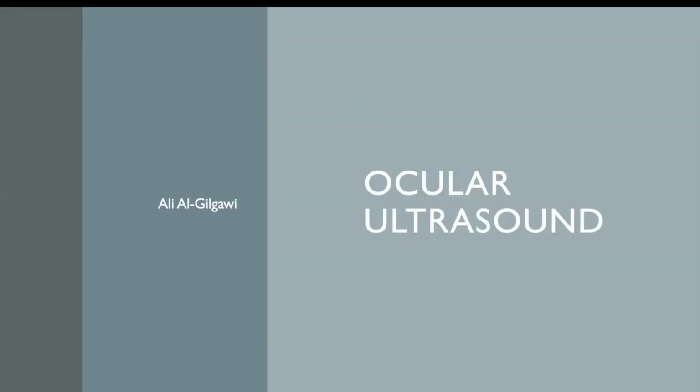So we'll be continuing on the investigation series, and I wanted to talk about ocular ultrasound today. It's not a particularly long tutorial, but I wanted to touch on essentially what it is, some brief comments on its indication, how to do it, and then also just going through some common things you might see when doing a B-scan ultrasound in your own clinical practice.